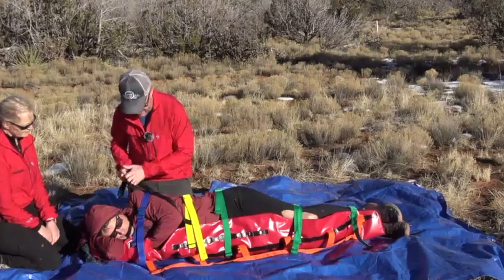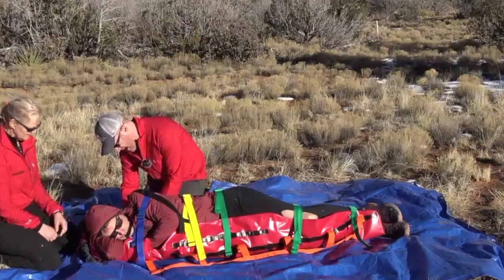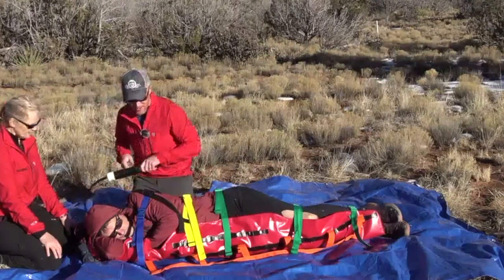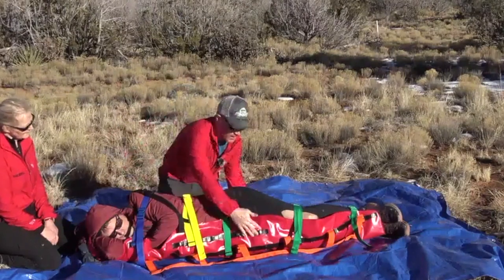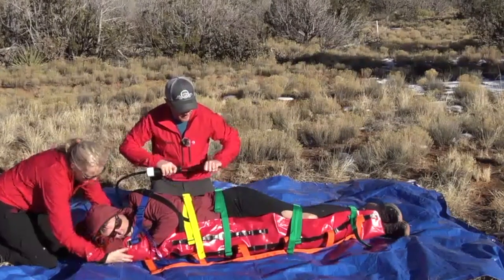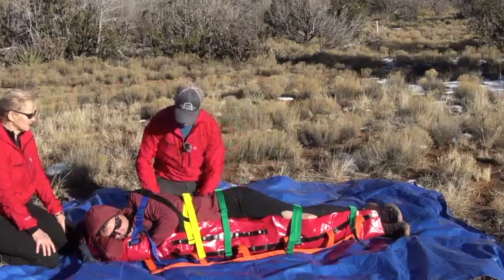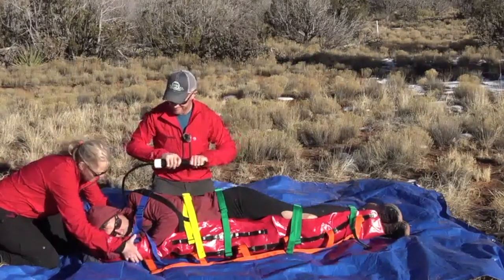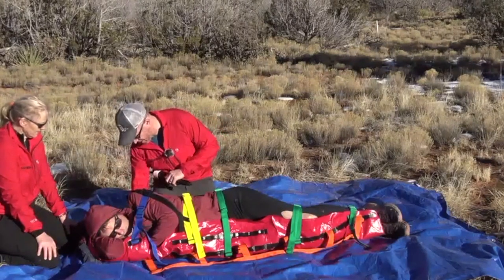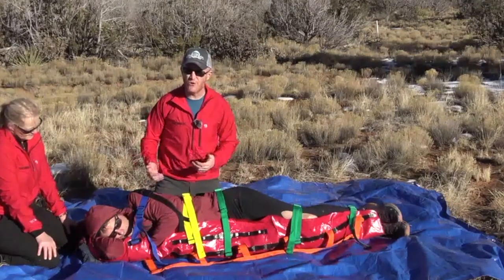We have our last strap in place. I'll go ahead and access my valve, make sure it's tight and snug, put my pump in, and then I'm ready to deploy my vacuum. If you've got a couple other people, they can help mold this in as we deploy the vacuum. Now we have a good vacuum — we'll go ahead and disconnect our pump, make sure the valve is snug, and put the valve cover back on. Aaron is now packaged, we're ready to move, and he's in a side-lying configuration.